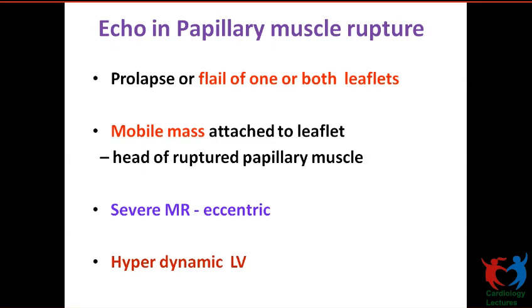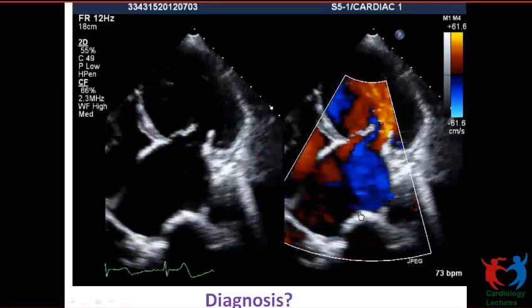Okay, so what is the treatment? Surgery. Ma'am, surgical repair. Surgery, yeah, but they may not give enough time for that. Okay, what is this?